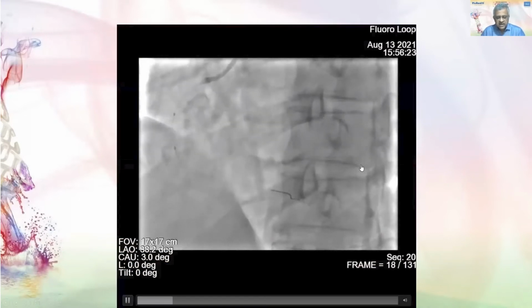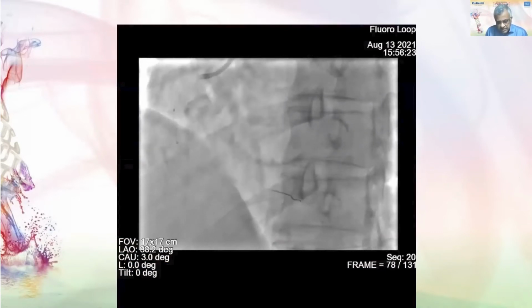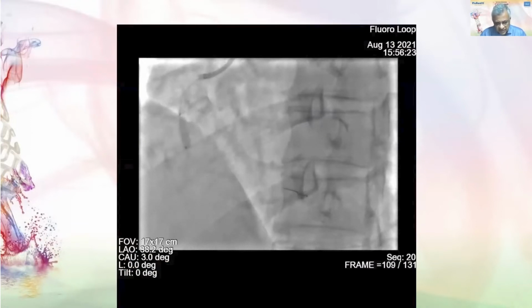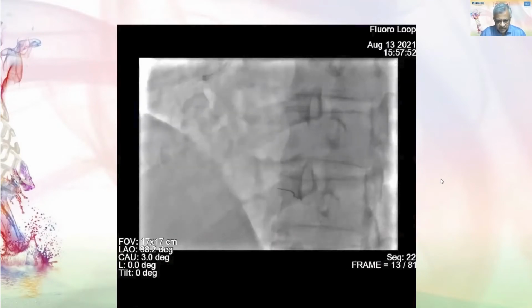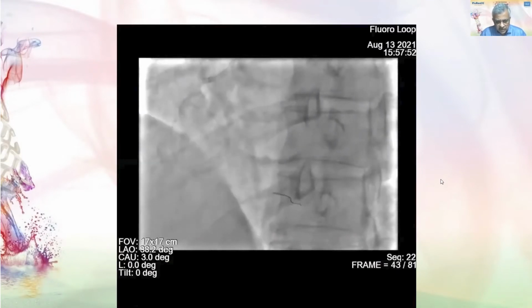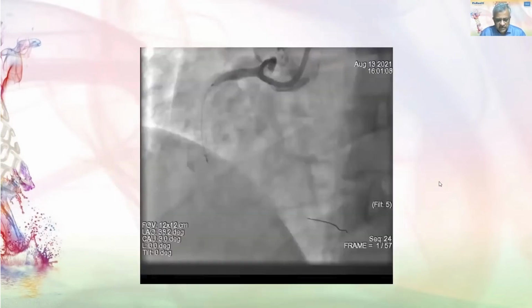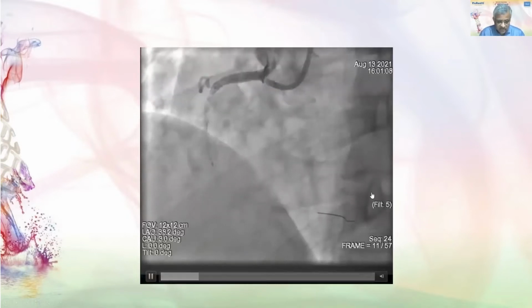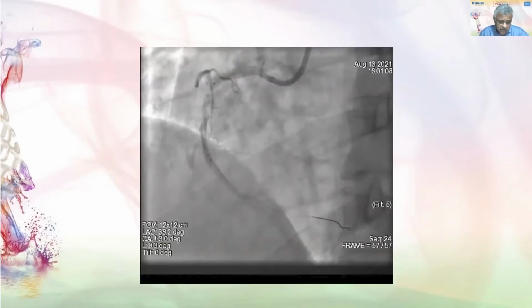So then we went ahead with the 4 millimeter. We decided to go in for a 4 into 29 millimeter MeRes. We first went ahead with the 4 into 15 Lineage balloon, pre-dilated it at nominal, slightly more than nominal atmosphere. Then during the pre-dilatation, we managed to slightly dissect the vessel, quite a significant dissection. So we did not take any other shots, but we went straight in with the BRS. You can see that the vessel has been dissected quite well.